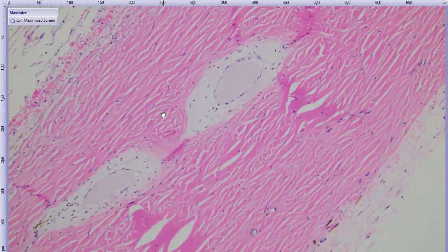And then all the corneal stroma stuff, probably edema and secondary changes from probably buphthalmos. And we wondered if, with the presence of the epithelial cells in there, there was collagenolysis and maybe even corneal hydrops previously in this case.